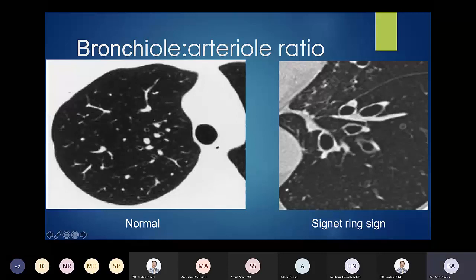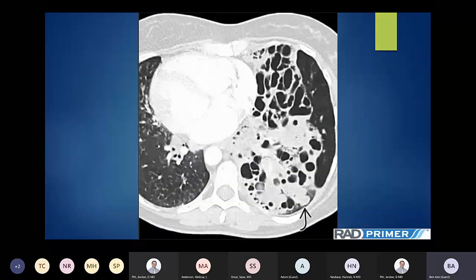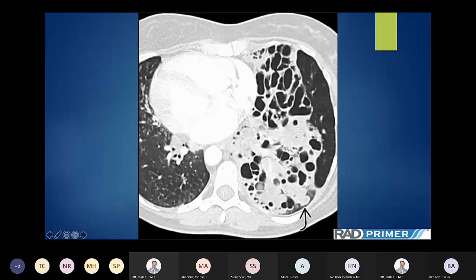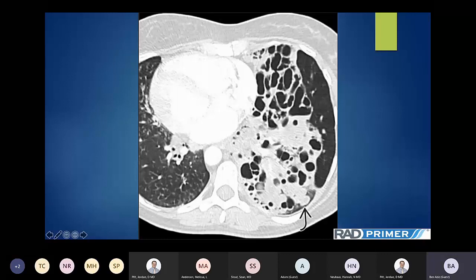Here's a pretty interesting, uncommon case. You can obviously see bronchiectasis of the left lung while the right lung looks relatively normal. But also notable: we have a right-sided heart — dextrocardia — and a right-sided aortic arch. We know we're in the mid to lower lung zone predominantly because we can see all four chambers of the heart. With bronchiectasis in the setting of dextrocardia and right-sided aortic arch, this points more toward Kartagener's syndrome. Other features of Kartagener's include hearing loss, nasal polyposis, and infertility, since it affects any organ with cilia.